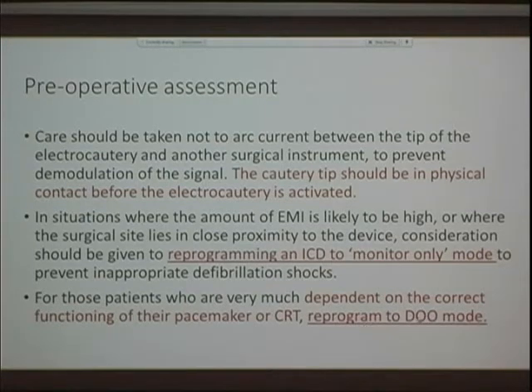Now, a magnet will also do this job, but if a magnet is in or near a surgical field, then you have no choice but to actually program it with a programmer. Now, I've run into this once before, where a surgeon's headlight will prevent the programmer from communicating with a device. And it's happened with Medtronic a couple of times. If your programmer does not talk to the device, maybe turn the surgeon's headlight off.